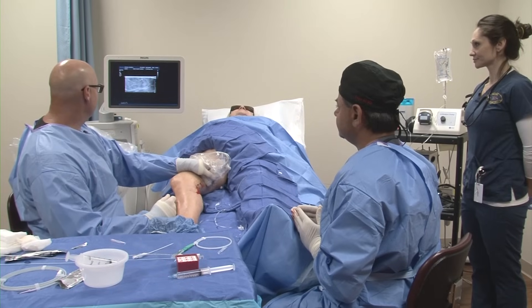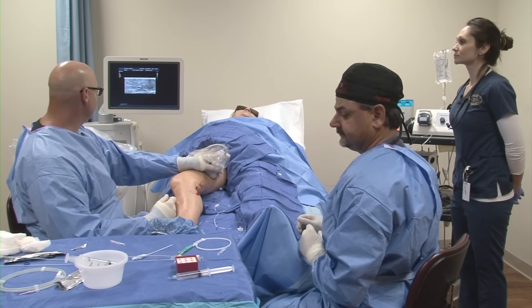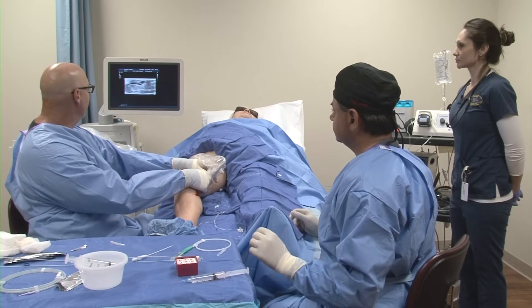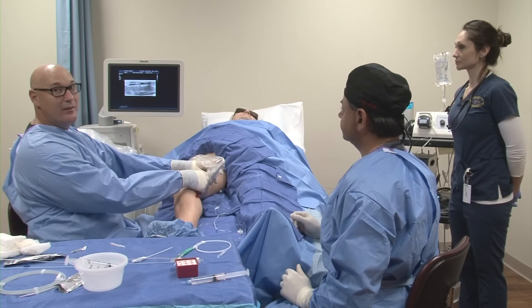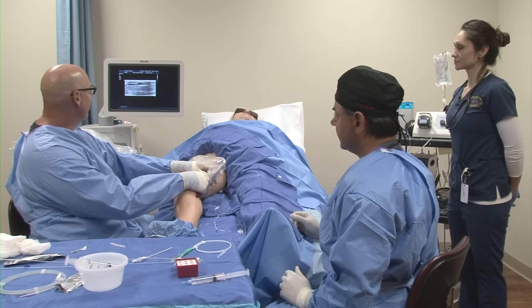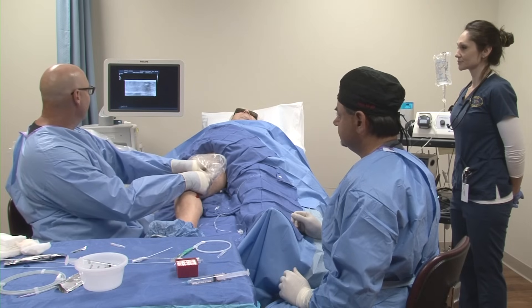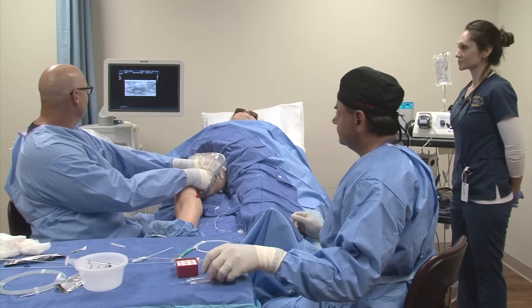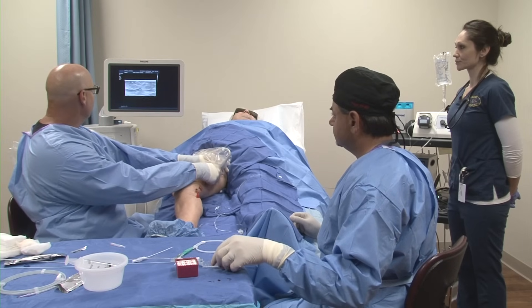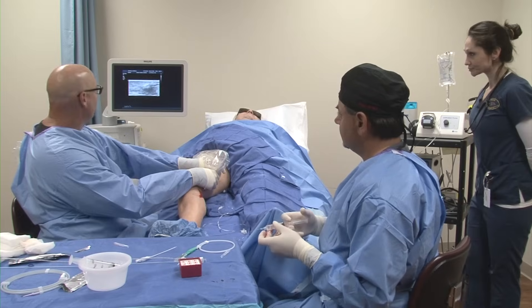Jason shows the wire confirmation: In the transverse view you can see the bright echogenic wire inside the vein. It's good to look at it in two views to make sure it stays inside the vein and doesn't exit. In the longitudinal view you can see how tortuous the actual vein is and the wire inside of it. On a scale of one to ten the access was a nine. Once we put the dilator in, it'll straighten out this area and hopefully give us a smooth run.